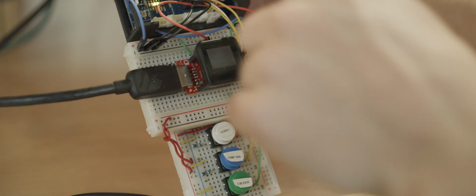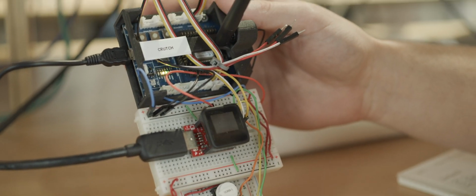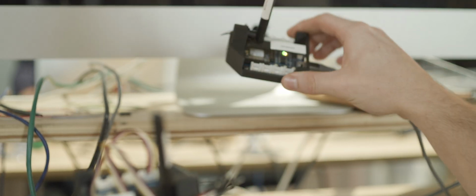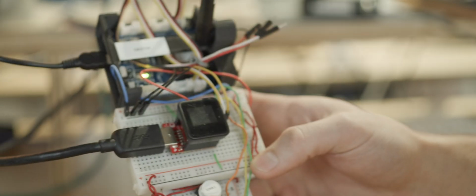And then this is the wireless communication device. It's called an XBee. So there will be one of these in the crutch, and then another one housed in the backpack somewhere. I also have a vibration motor taped to the back here so that we can get some vibration feedback for the user.